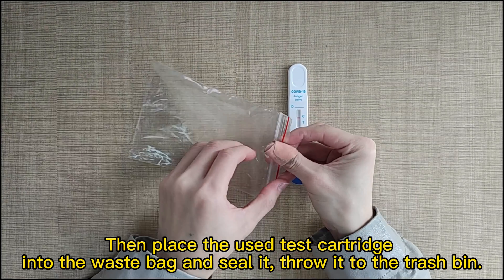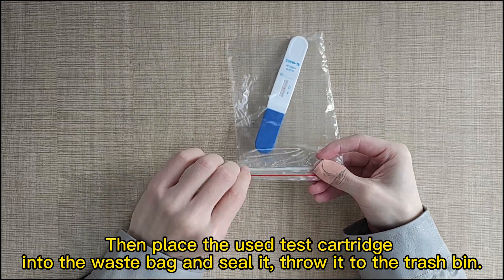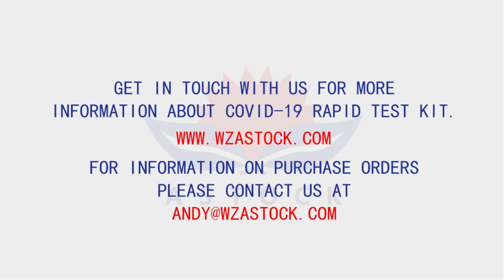Then place the used test cartridge into the waste bag and seal it. Throw it in the trash bin. Thank you.